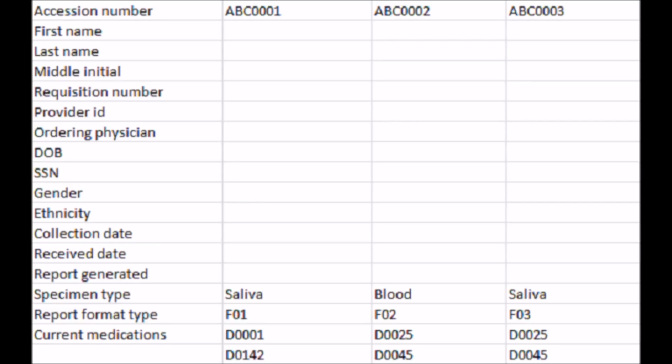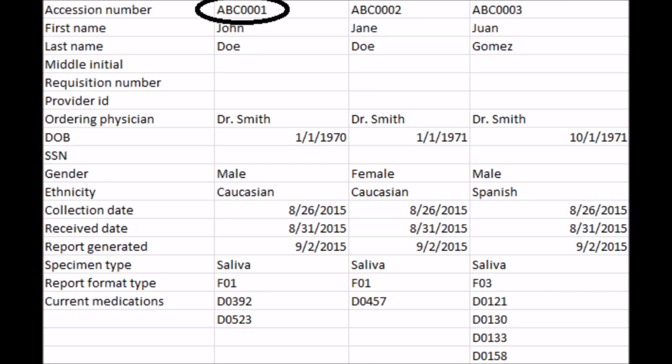ambiguous haplotype data. To achieve the most comprehensive and predictive report, it is recommended that you complete the form as thoroughly as possible. We also recommend you download the patient medication list from our website. Including all medication the patient is currently taking is vital.